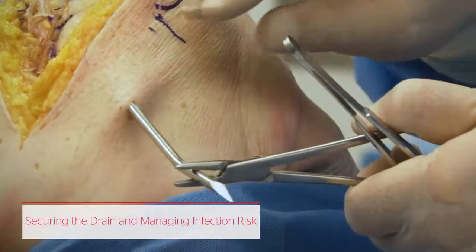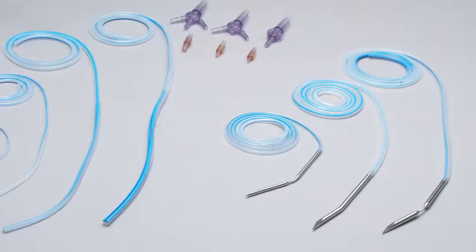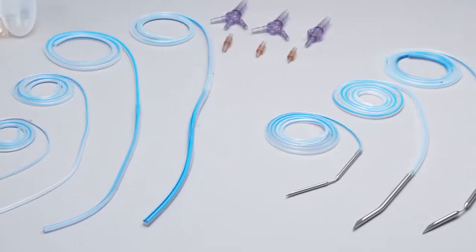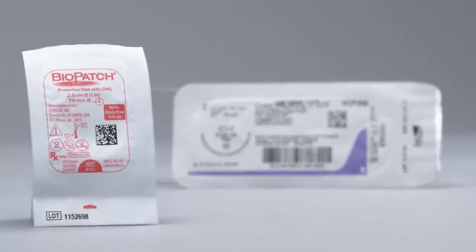Securing the drain provides even more opportunities to potentially improve outcomes by addressing key risk factors for local infection. Ethicon's unique product offering combines Blake drains with two products designed specifically for infection risk management: plus antibacterial sutures and Biopatch disc.